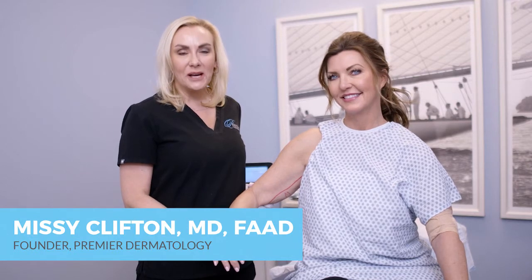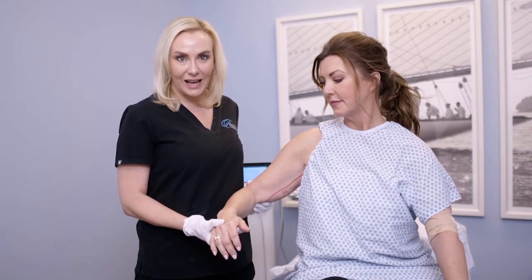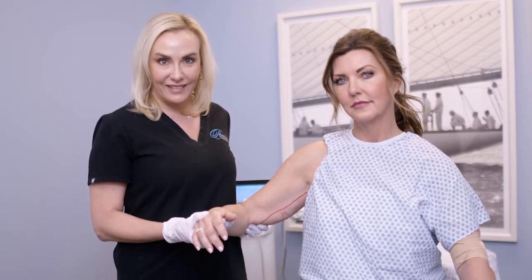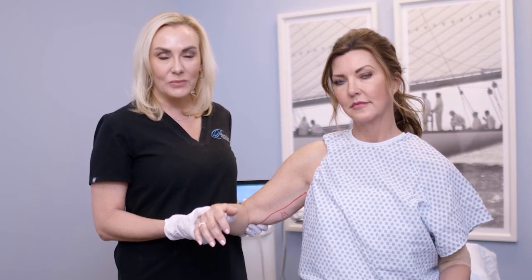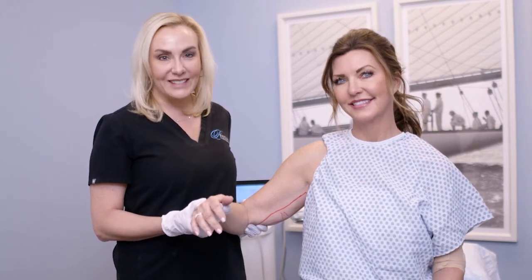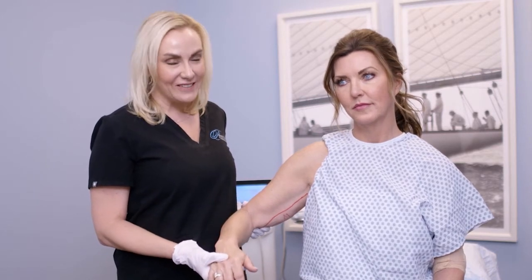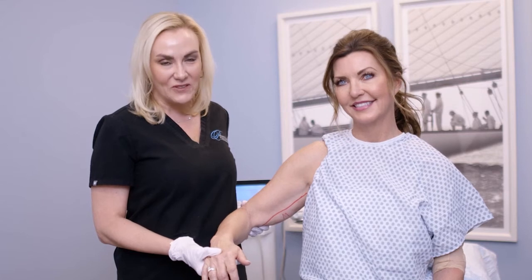We're going to be doing a couple of procedures on her upper arms. We're going to be doing the body tight procedure, and then we're going to be doing the Morpheus procedure. Both of these are radio frequency energy. The body tight will be a cannula that actually will go underneath the skin. So a little spoiler alert, we will be entering the skin with this little cannula. It's blunt, it's not sharp. She's already been completely numbed, so she's gonna feel really comfortable. It's not gonna be painful.